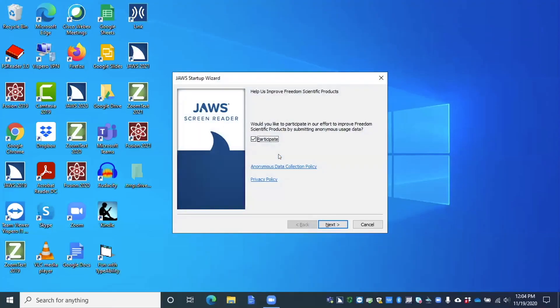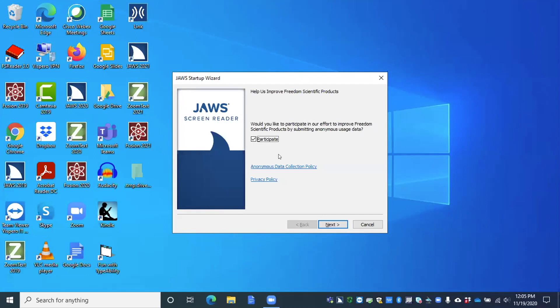Help us improve Freedom Scientific products. Would you like to participate in our effort to improve Freedom Scientific products by submitting anonymous usage data? Okay, so here on this first screen, there are several screens here in the Startup Wizard. So here on the first screen is a checkbox about anonymous data usage. Now, this data is simply used to improve our products and also improve the experience for you, the user. So we don't save this information, we just use it to make those improvements in our products. Now, you need to have this box checked in order to use certain features like PictureSmart and Voice Assistant, which we'll tell you about those here in just a little bit.